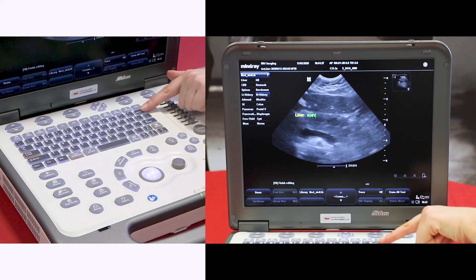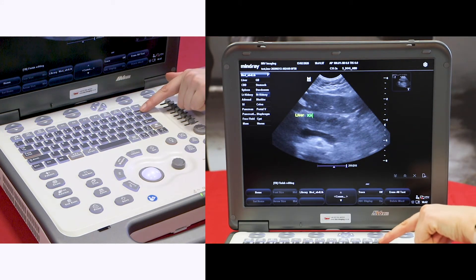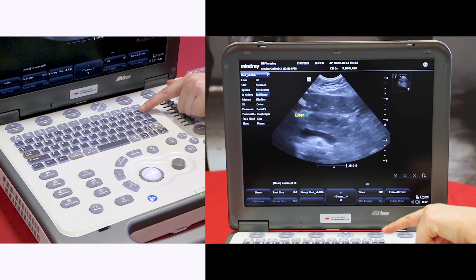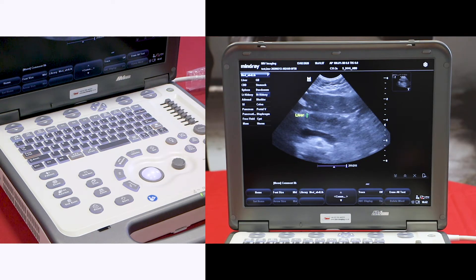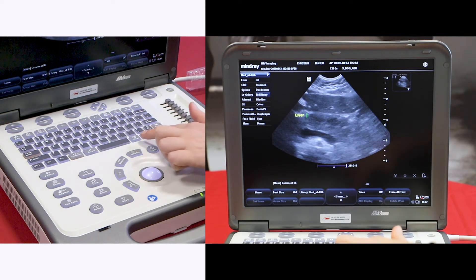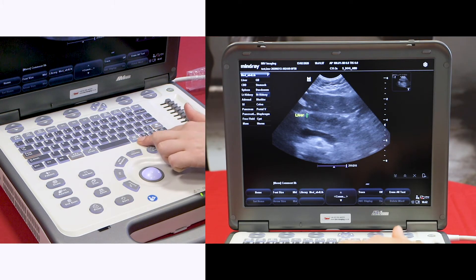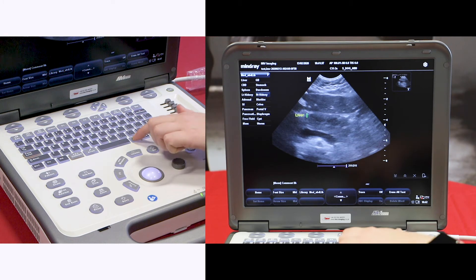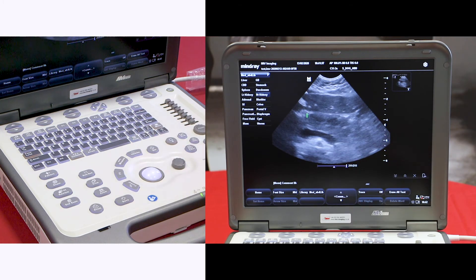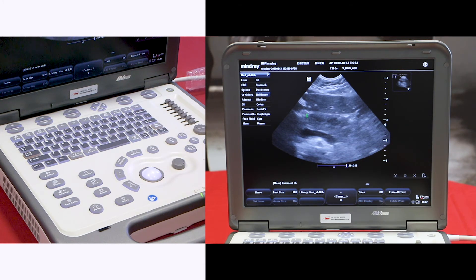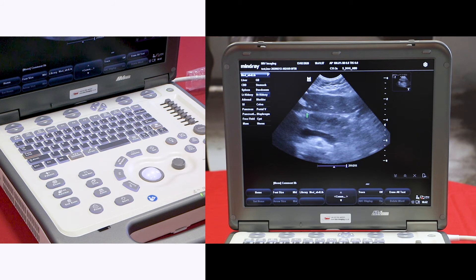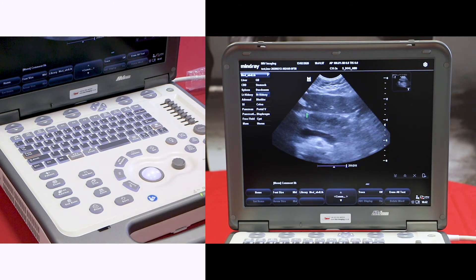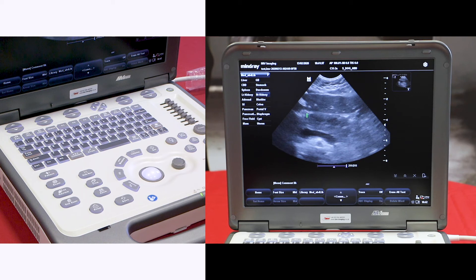You can backspace to delete, or press the clear button to the right of the spacebar to remove all your comments. After you've added comments, press save to ensure the image is saved with your comments.